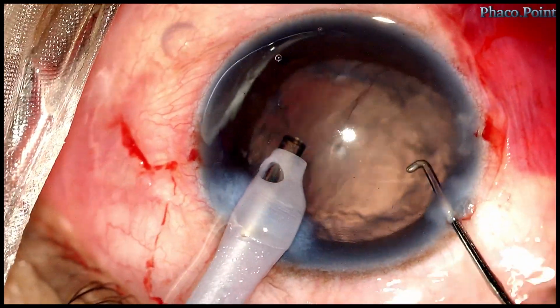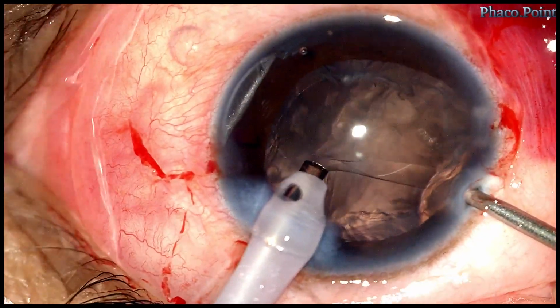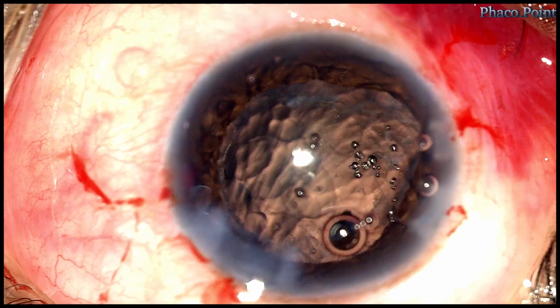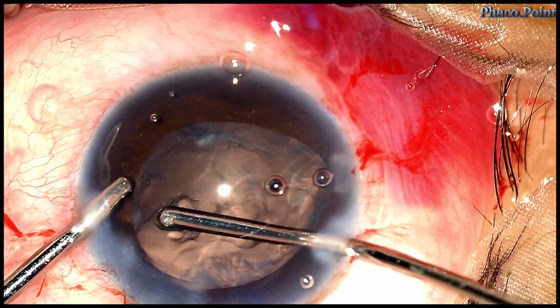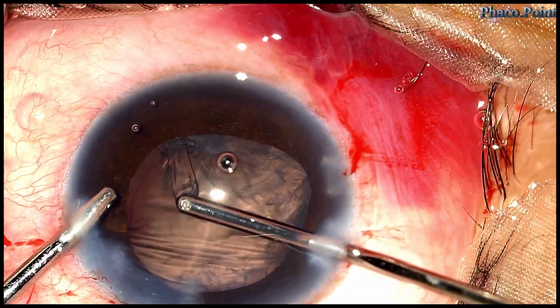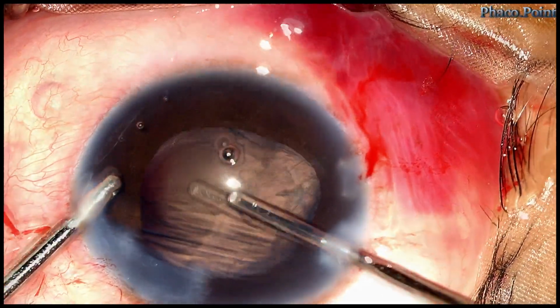At the end of the epinucleus removal, it's important, as you can see here, to perform a viscofluid exchange. We now proceed to the bimanual irrigation aspiration. With care and caution, the cortex is removed circumferentially. Before swapping the irrigation aspiration in the other hand, once more you'll notice how I perform a viscofluid exchange.